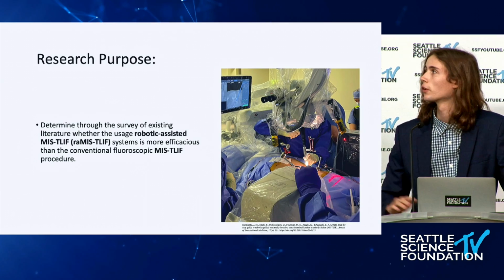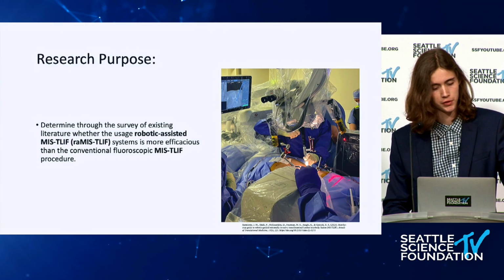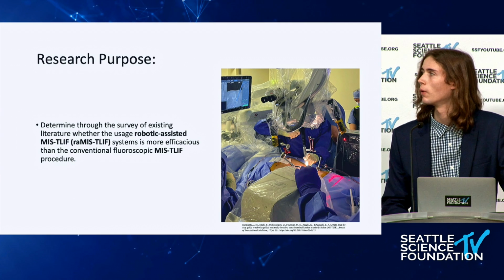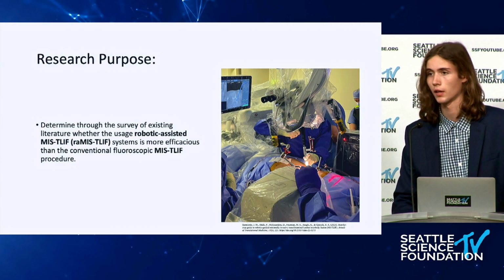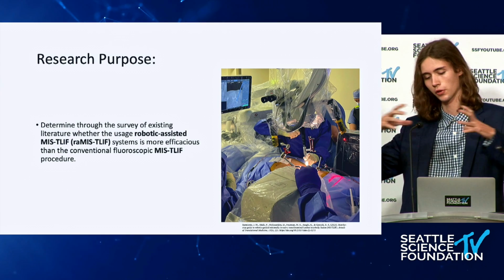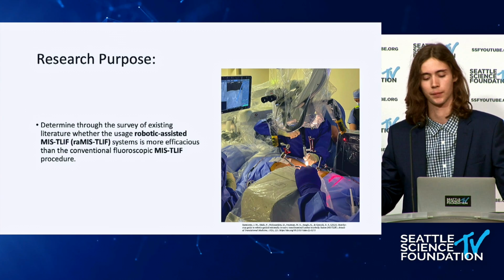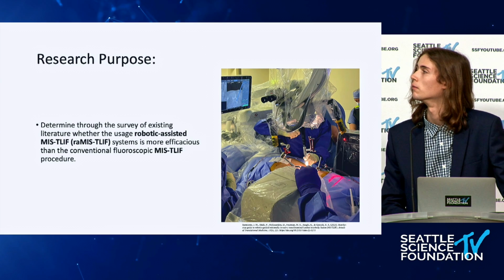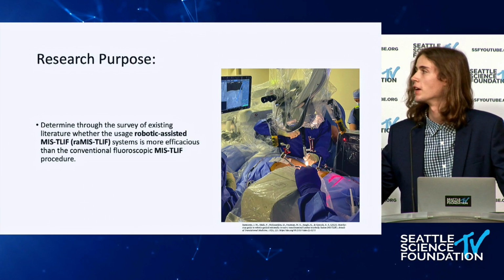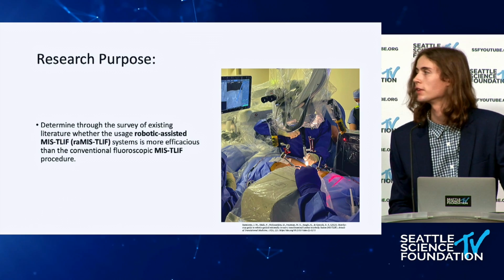Circling back to my actual research, the purpose of it was to determine through a survey of existing literature whether the usage of robotically assisted MIS TLIF, which is basically minimally invasive TLIF, so instead of an open surgery, it's a 4-centimeter incision guided by X-ray, compares with the conventional fluoroscopic X-ray MIS TLIF procedure.